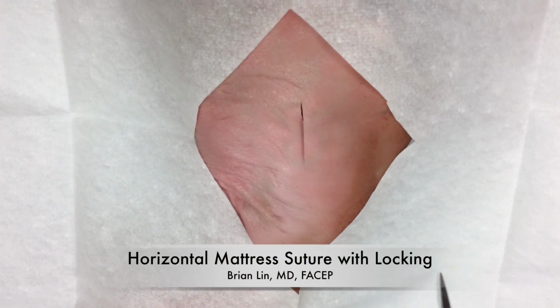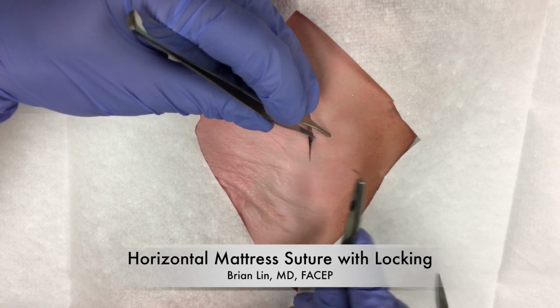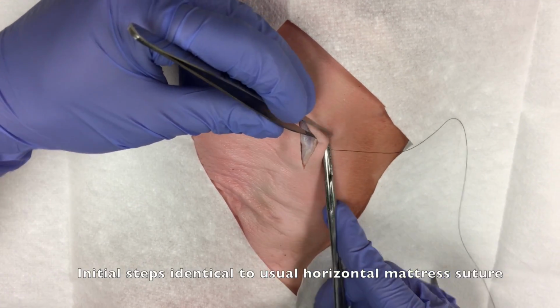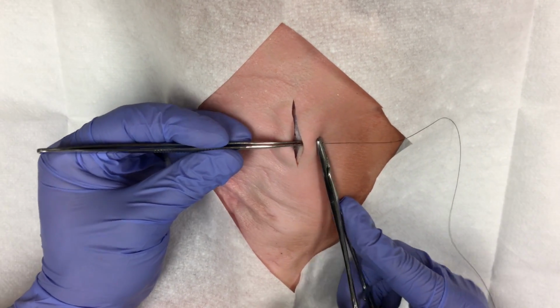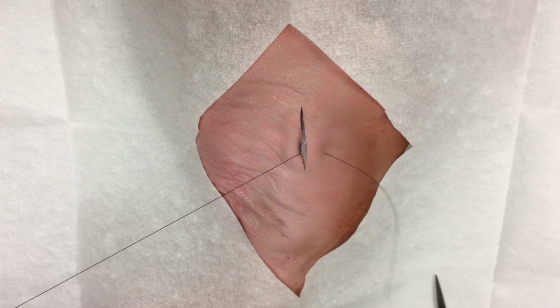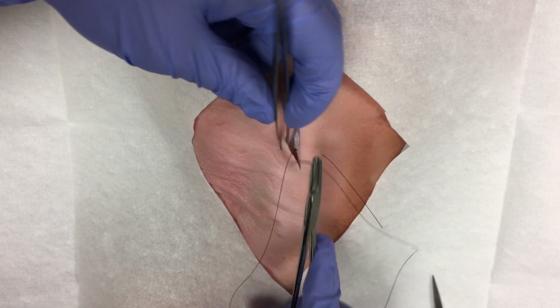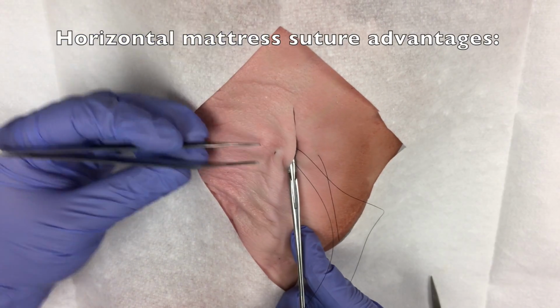This video describes placement of a horizontal mattress suture modified with a locking technique. Initiation of placement of this suture is the same as with a typical horizontal mattress suture. You'll take a larger bite, usually about a centimeter from one of the wound edges. You'll pull your suture through the center of the wound, and you'll place your suture equidistant, exiting the tissue on the opposite end of the wound.